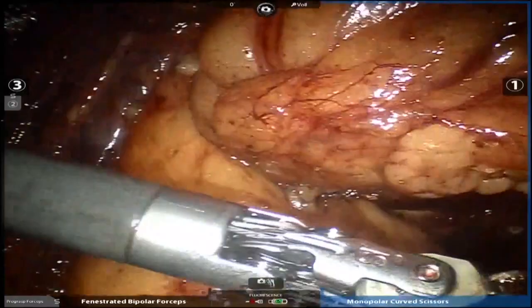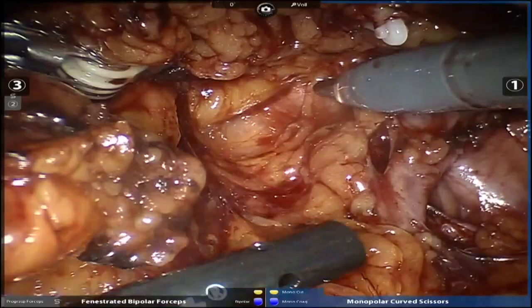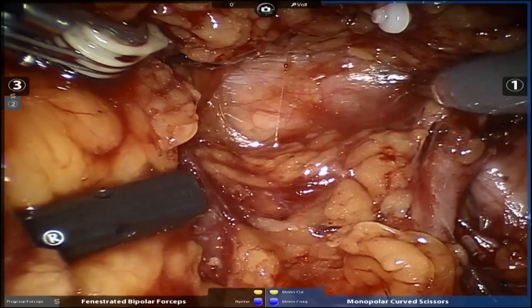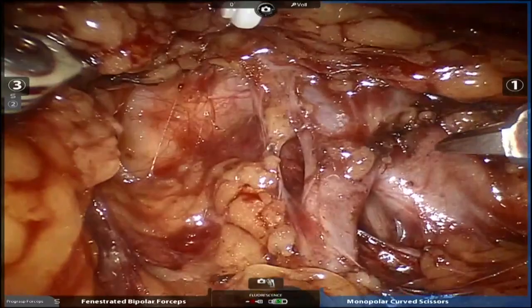So what I'm going to do is play with the exposure and make sure that I have good movement. Okay. You want to look if there's a lower pole artery, or what is your plan now? Yeah, there's another vessel in here. I just can't ignore the imaging. The imaging suggests there's another vessel that I have not seen yet. Because if there's a lower pole artery, you must get it with this lower pole channel.